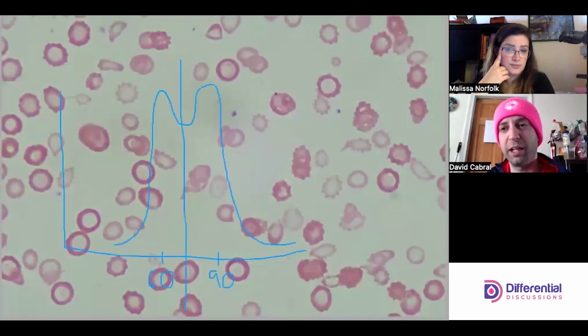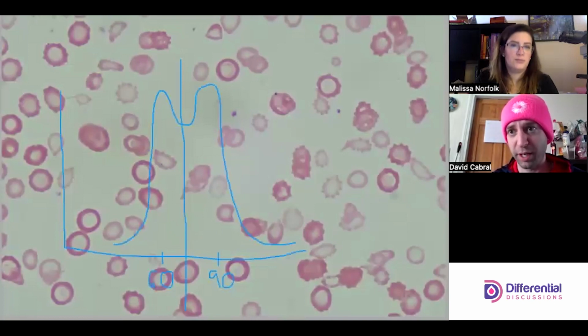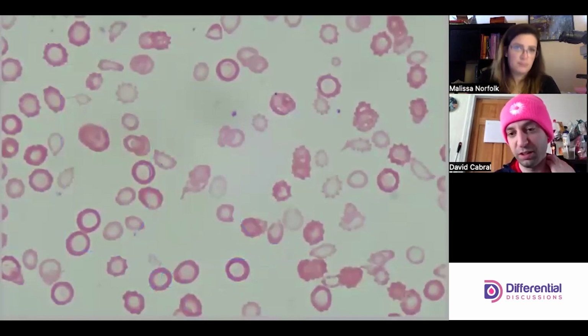And this is where theory empowers you at the bench. I know that there's probably a lot of techs, or maybe even students, thinking, when am I going to use this stuff? And you get to choose when you use this stuff. It certainly is applicable at the bench and can help patient outcomes. So I encourage people to think about these things. This is how processes get changed. I think a lab should discuss whether or not an MCV should be released in a situation like this. But that's for administrators.